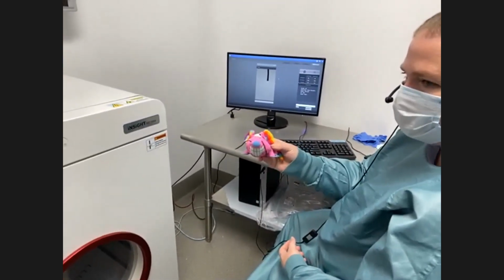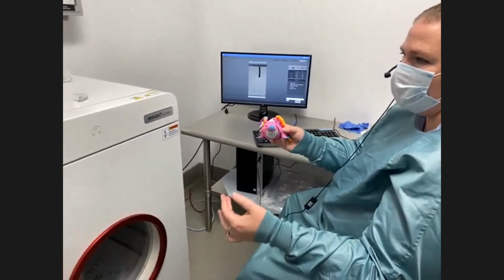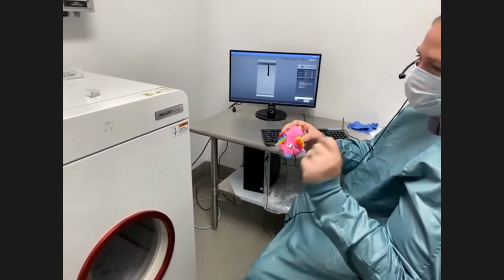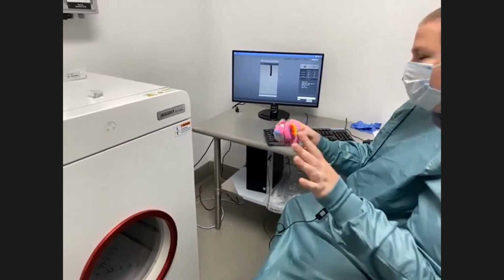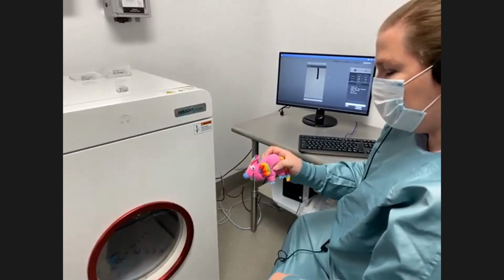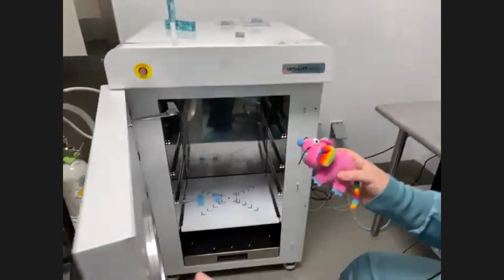Once the animal is anesthetized, we would turn on the isoflurane to the vaporizer going into the instrument. If you get a vaporizer with the instrument, there would be 2 channels, one to allow you to have the knockdown chamber and one then to send it to the system. The way we have it set up here, they're separate vaporizers. So we turn on the isoflurane, I get my animal ready, and I'll have my colleague help me with that.